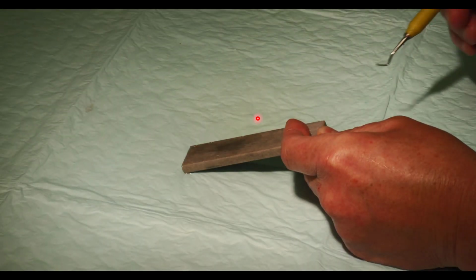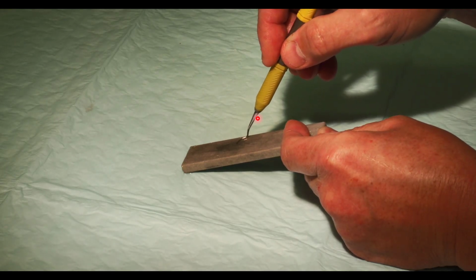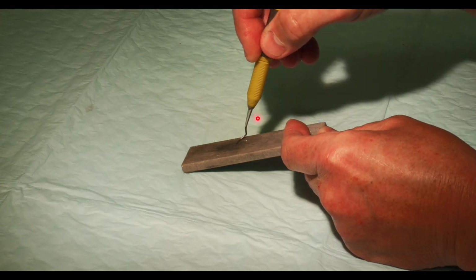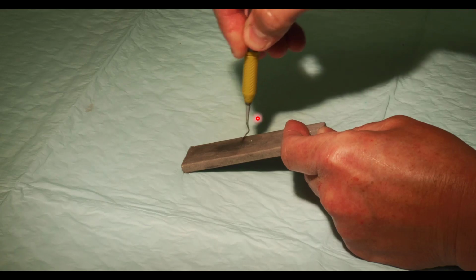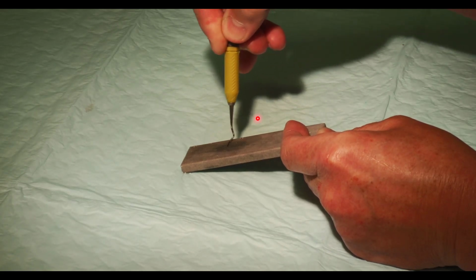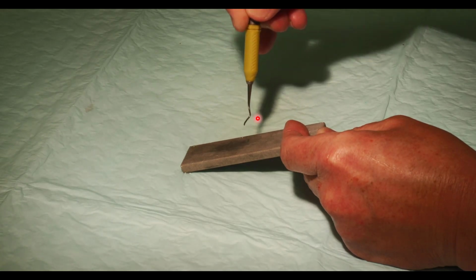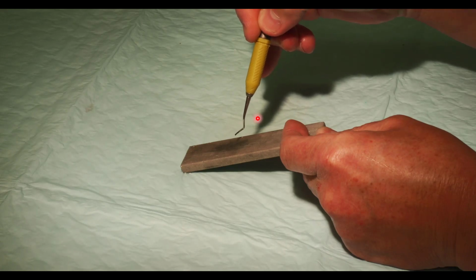To sharpen a curette, it's very similar. Again, put the instrument on the stone the way it would be on the tooth with that terminal end parallel to the stone, and then rotate it up 20 degrees off of it, back and forth, end coming towards you. You may want to rotate it in your hand to get that whole curve, just like this. And again, always end on the pull stroke, and that will get it nice and sharp. And you do only sharpen that one side of a curette.